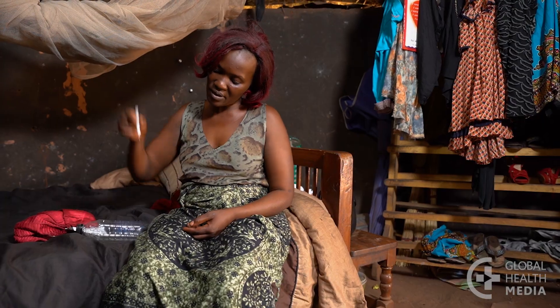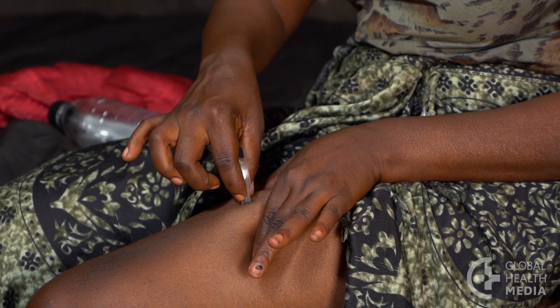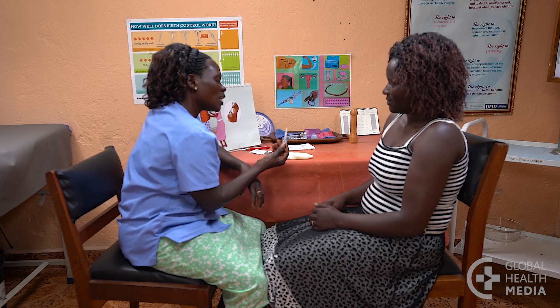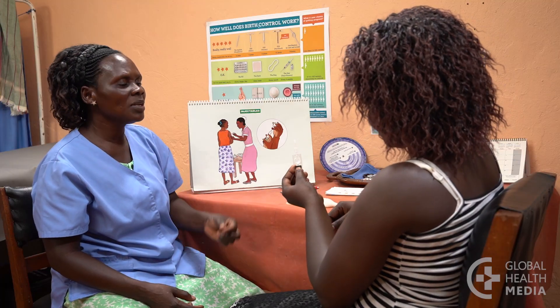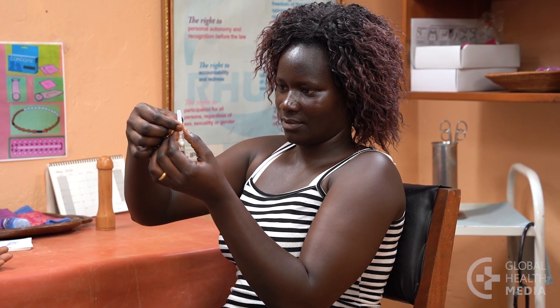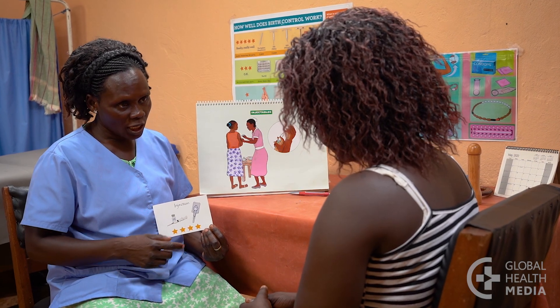Depo Sub-Q comes in a pre-filled syringe and can be given by a woman herself at home. It's simple, quick, and safe, and prevents pregnancy for three months. It can also be given by a health worker. This video will describe Depo Sub-Q and show the steps to teach a woman how to safely and confidently give herself the injection.